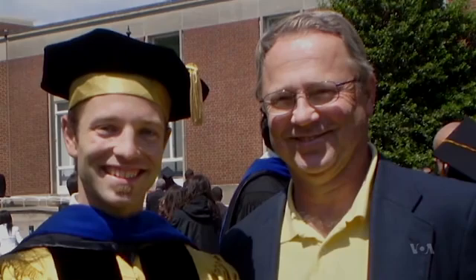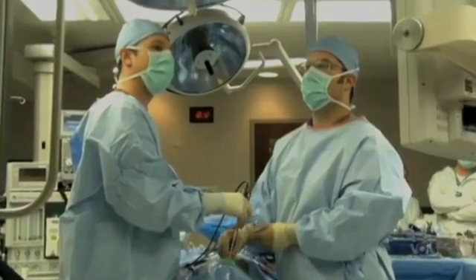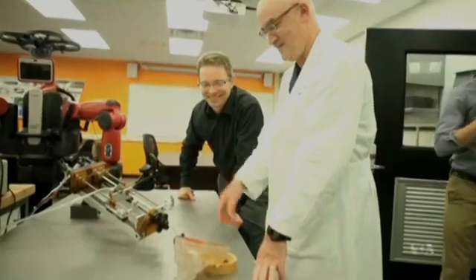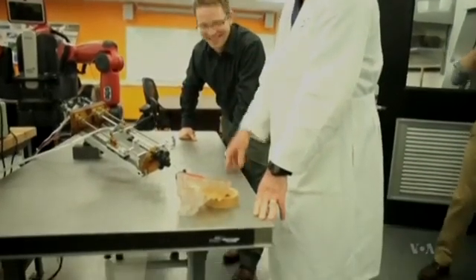Webster's father survived, but 40% of those who have this medical problem do not. That's because there's very little doctors can do for these patients, according to Dr. Kyle Weaver, a neurosurgeon who's working with Webster on this project.